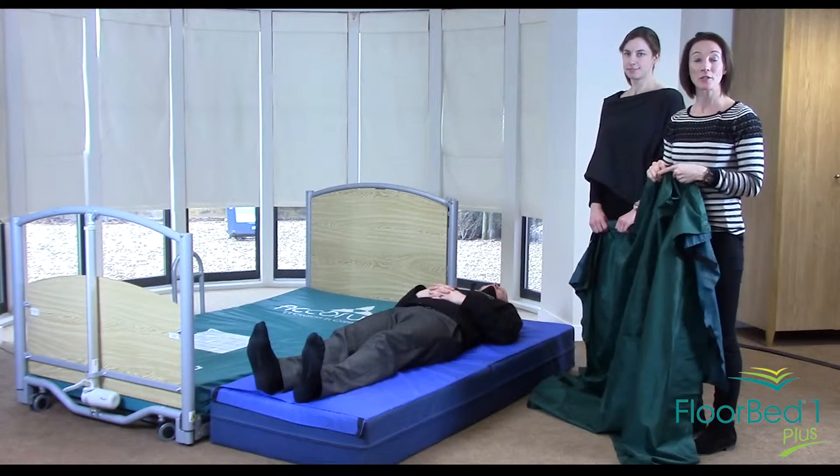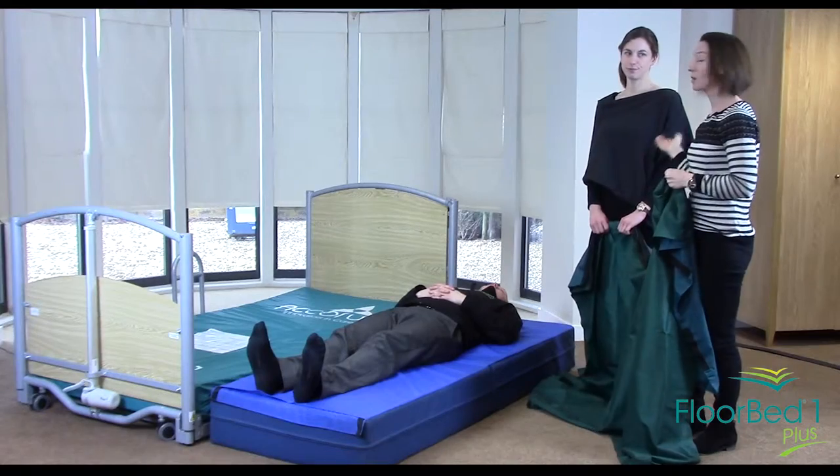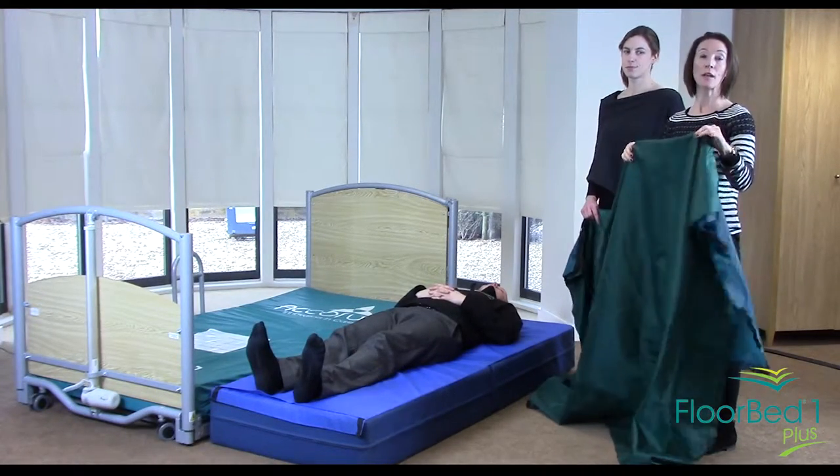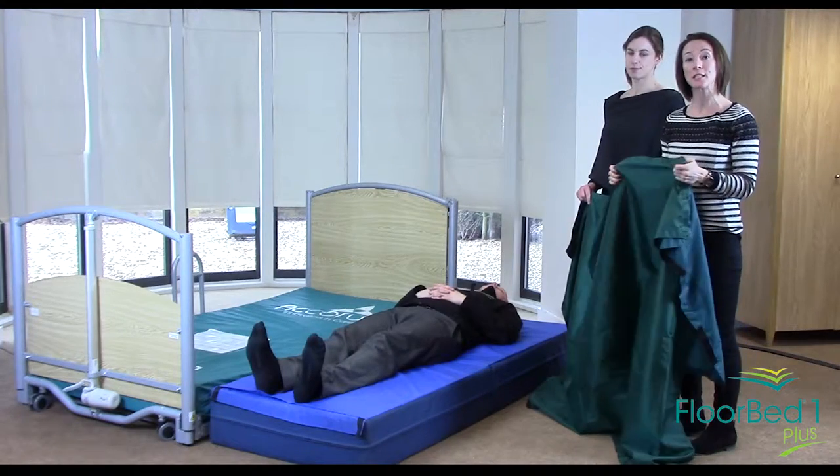Hello, my name is Debra and I'm an occupational therapist. Today I'm going to be working with my colleague Lucy to demonstrate how you can use a safety mat and two flat sliding sheets to slide someone back into bed.